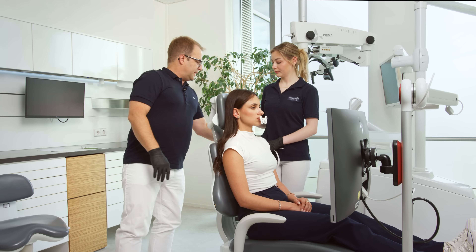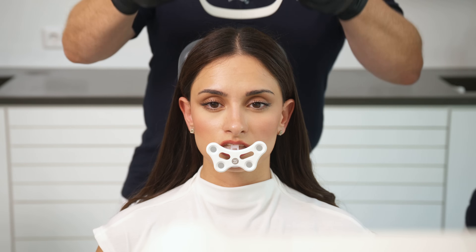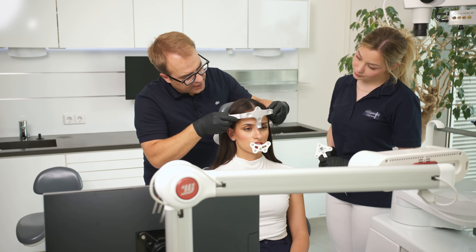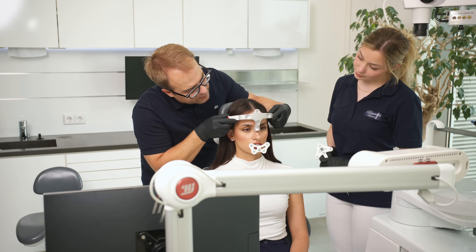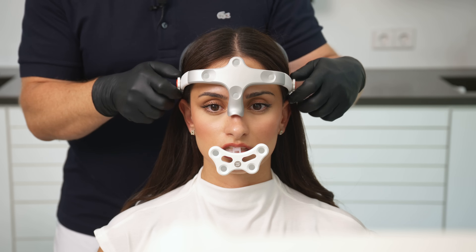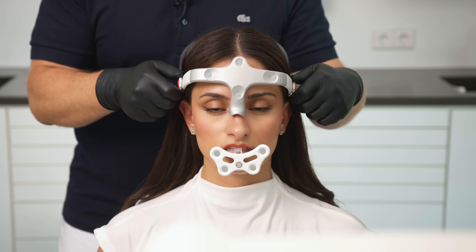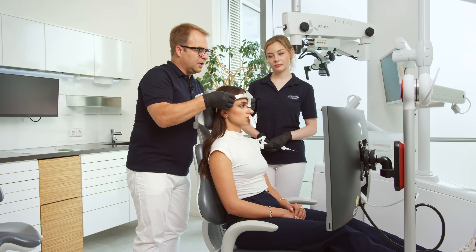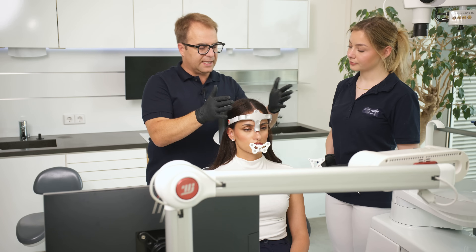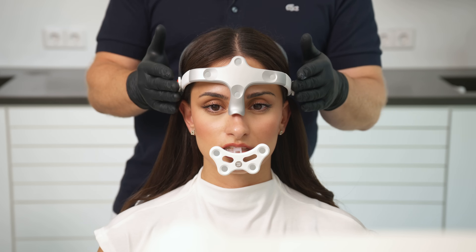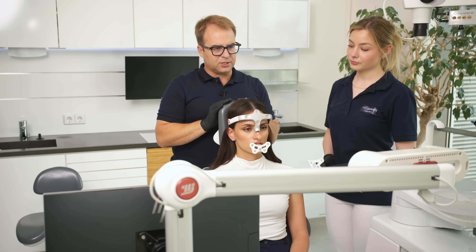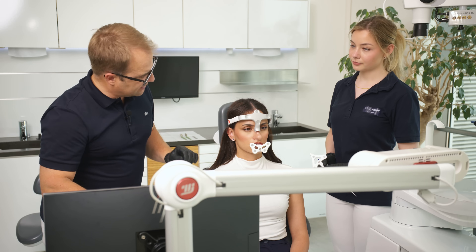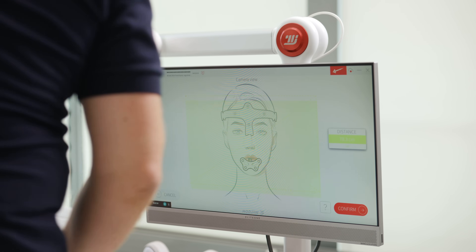The next step is placing the tiara on the patient's head. The screws help attach the tiara securely. The head should rest on the chair and the patient looks straight forward to the camera. Once everything is attached, I confirm the placement.